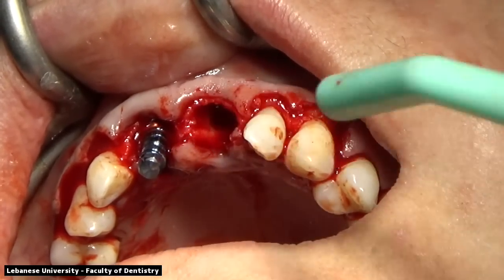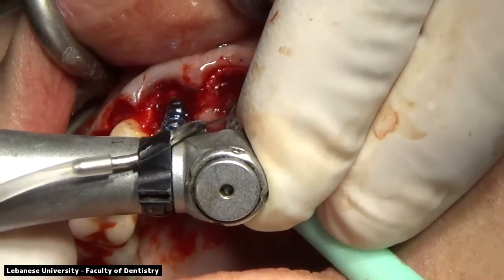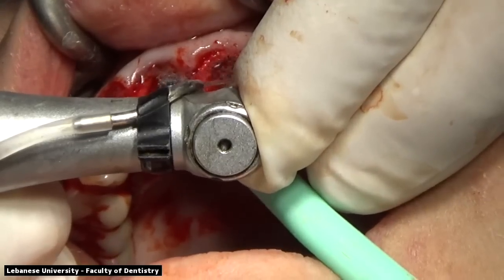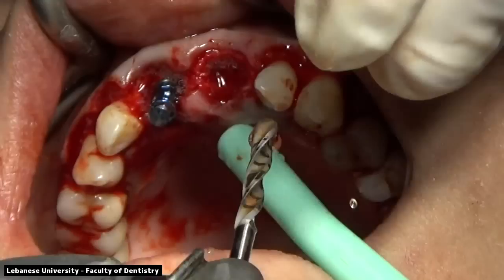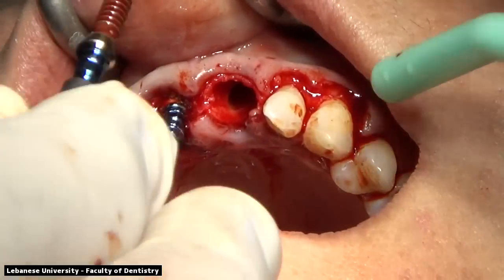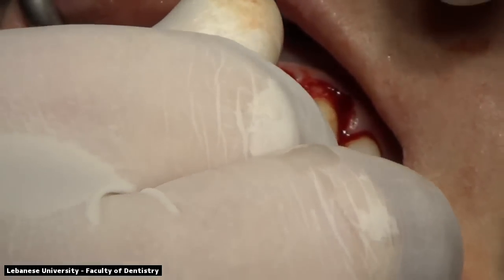After placement of this implant, it was noticed that we need to drill a bit deeper at the palatal aspect. So we removed the implant by hand and we're drilling to a deeper point, going to the palatal with a 3.3 millimeter drill and reinserting the implant by hand to a deeper level at the palatal aspect.